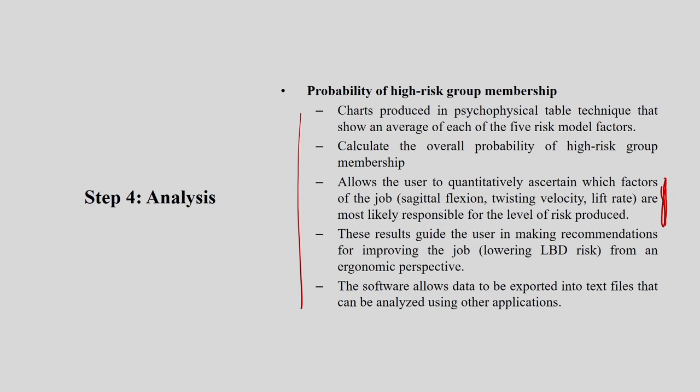The software also allows data to be exported into a text file that can be analyzed in any other application. So this is how you are going to get data. You are going to analyze it, and you can export it as per your requirement.